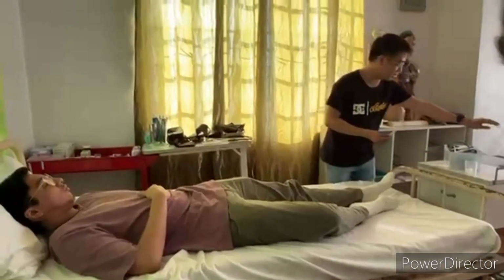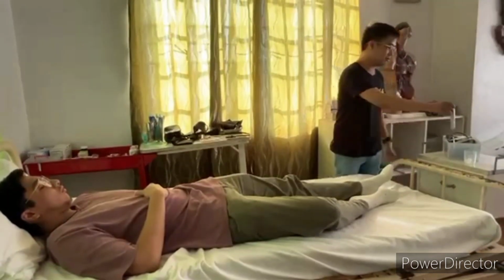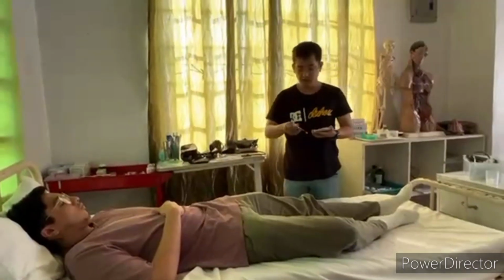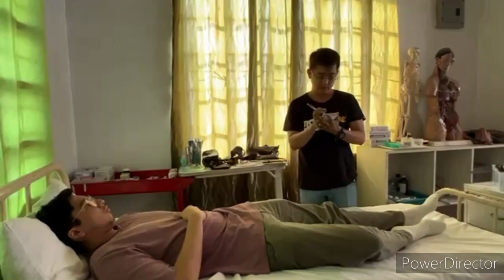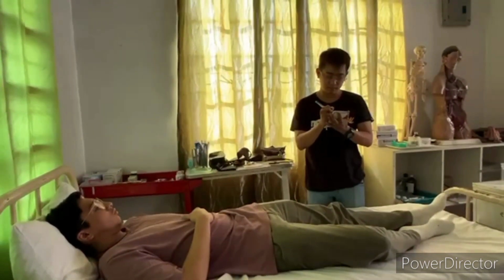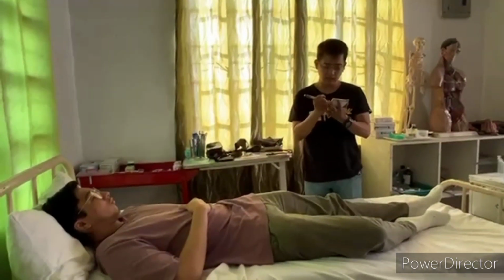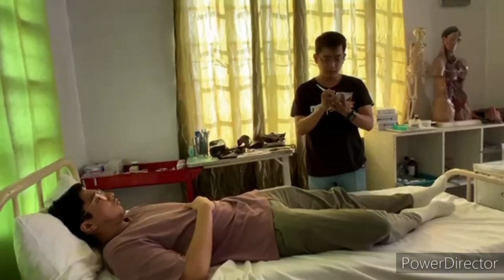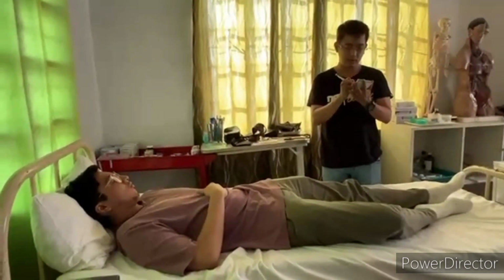Put it back in the receptacle. Okay, put it in the box. And then record everything. Record the TPR of the patient. So temperature of the patient is 36.5 degrees Celsius. Pulse rate is 80 beats per minute. And then respiratory rate of the patient is 20 cycles per minute.